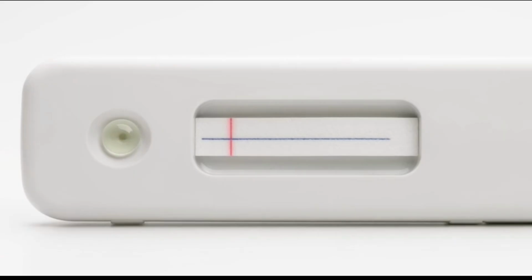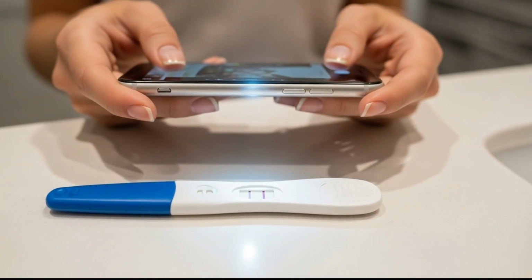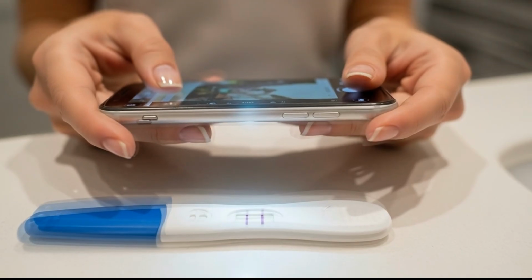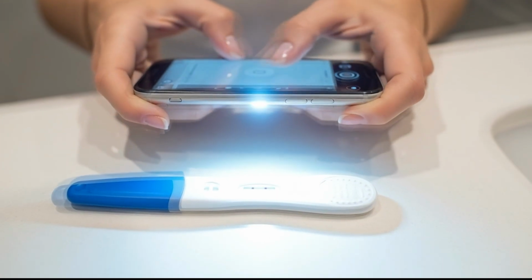Here's a myth I want to gently correct. Some people believe if the line fades, it means miscarriage. That is not medically accurate. A drying test can lighten. Lighting conditions can change what you see. Camera flashes can distort color. A faint line on a single test does not diagnose anything. Doctors look at progression over 48 hours, not minute-to-minute strip changes.